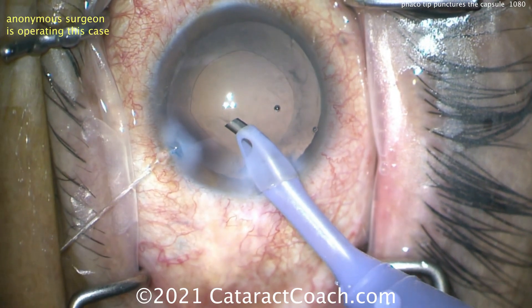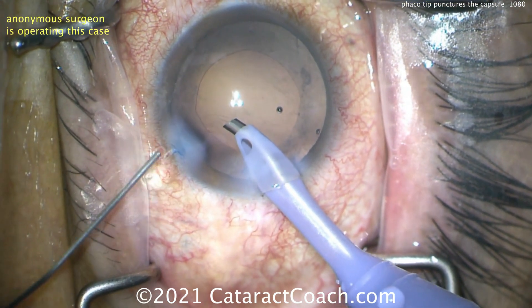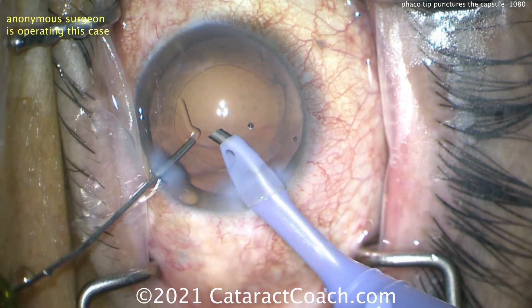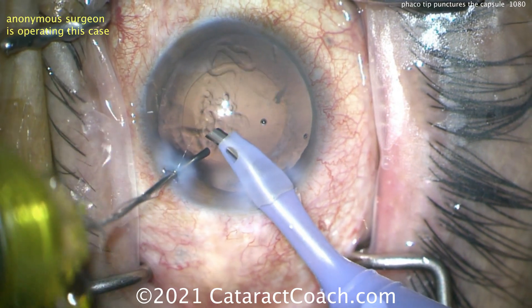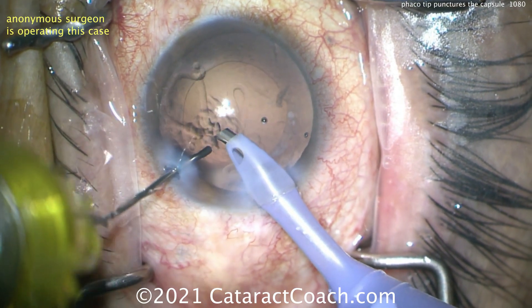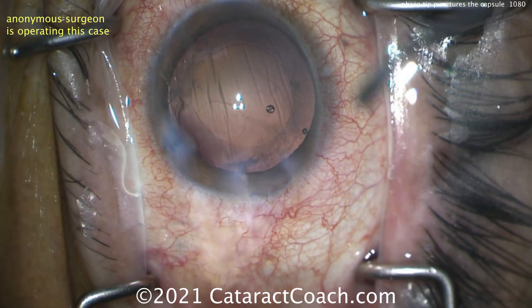Now what? Don't panic. Keep the probe in the eye, take the chopper out, and fill up the capsular bag — pressurize the eye with viscoelastic. Here's the mistake though: the foot pedal has to slowly go to position zero, because otherwise if you keep the infusion on, look — all these strings of vitreous just fly right out.